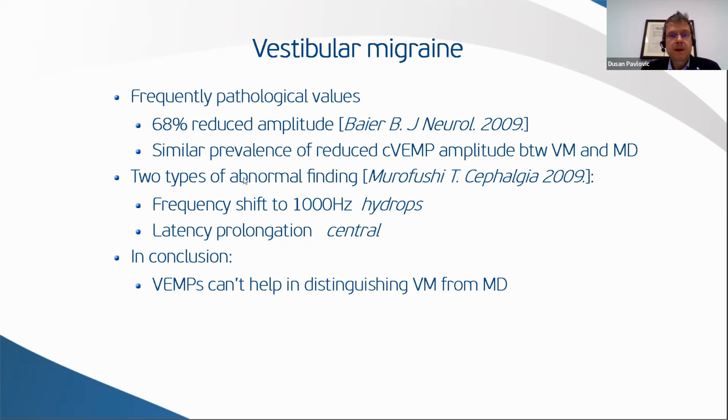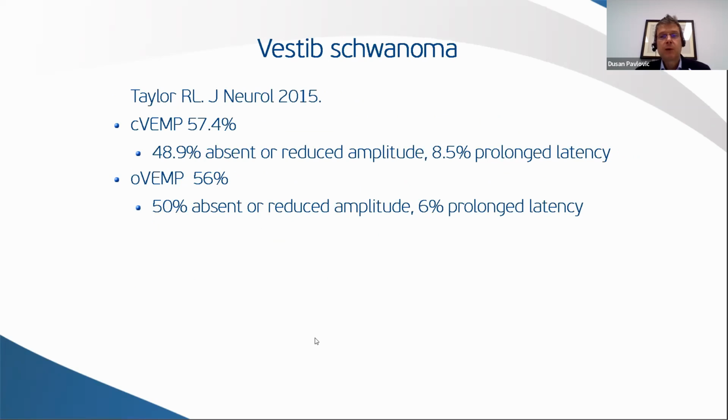But frequency shift, for example, is characteristic for hydrops. But the conclusion is actually that VEMP testing can't help us to distinguish patients with vestibular migraine from patients with Meniere's disease. What about vestibular schwannoma?